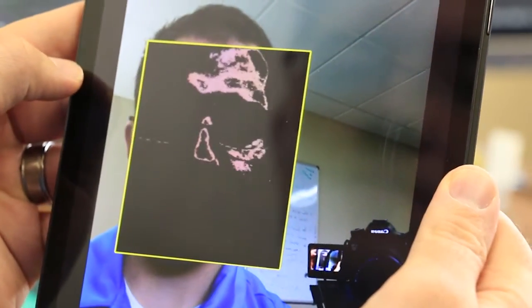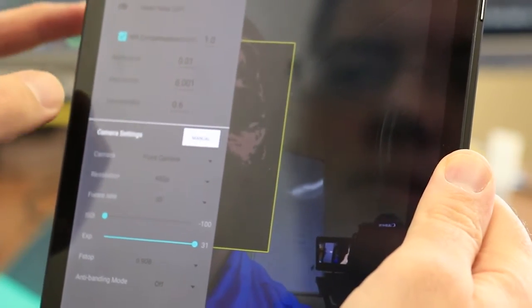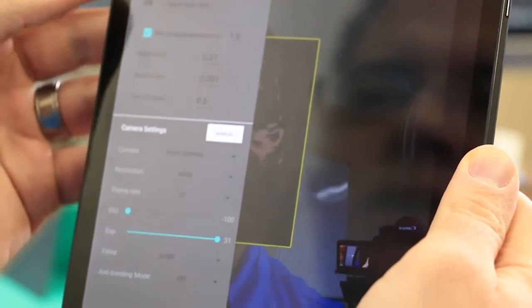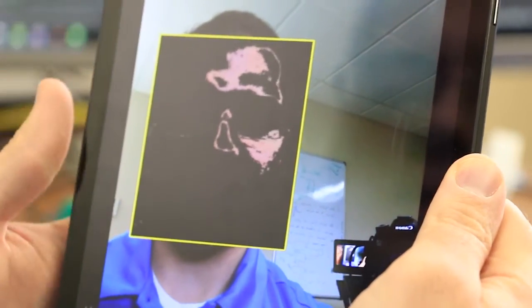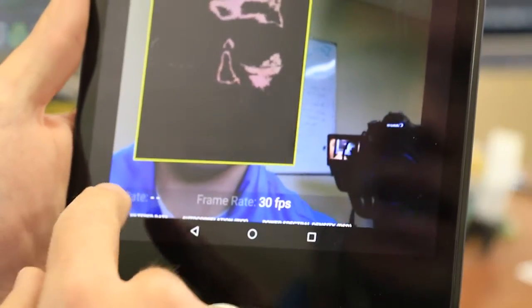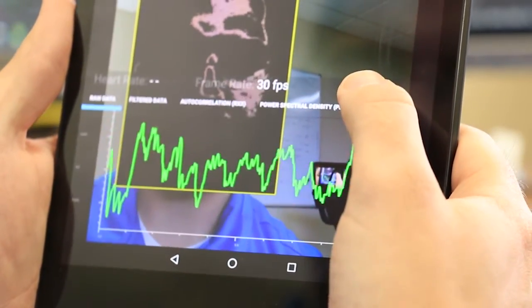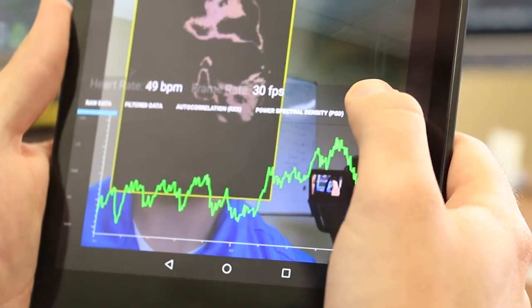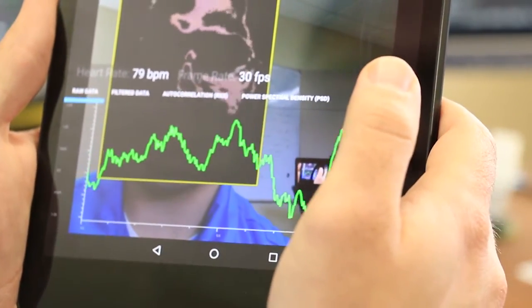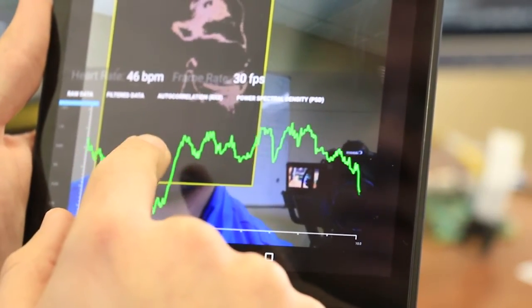Let's take a look now back over here at the algorithm settings. Here we have a couple of different algorithms which we can use. I'll just point us to this first one for demonstration. At the bottom here I have a pane that will show me my heart rate and the current frame rate of the camera. If I swipe up, I get a live data feed of the signals that my algorithm is consuming. This first one is the actual raw data, and what I'm plotting here is the average green color of all the pixels on my face.